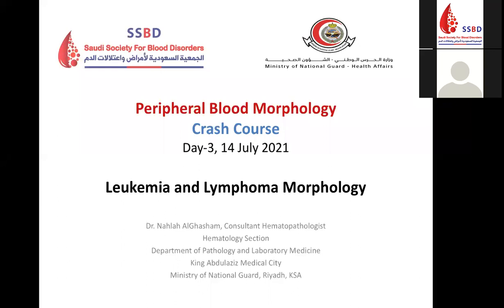Today I'll talk about leukemia and lymphoma morphology, the peripheral blood morphology in the blood smear. As you know, this is a very big topic. Leukemia and lymphoma are a heterogeneous group of diseases. We have a dedicated book, the WHO classification for hematopoietic disorders, so it wouldn't be logical to present all the morphology of all the cases.